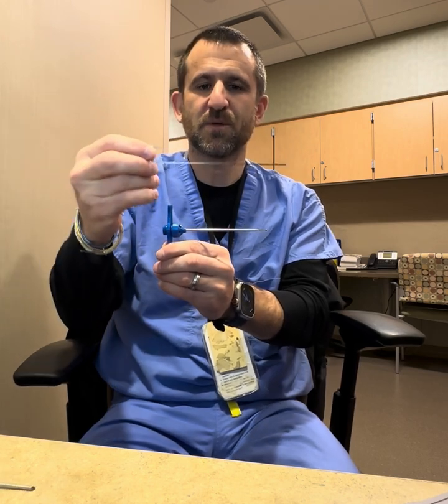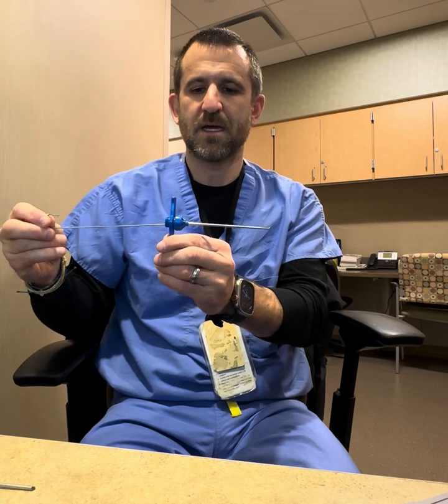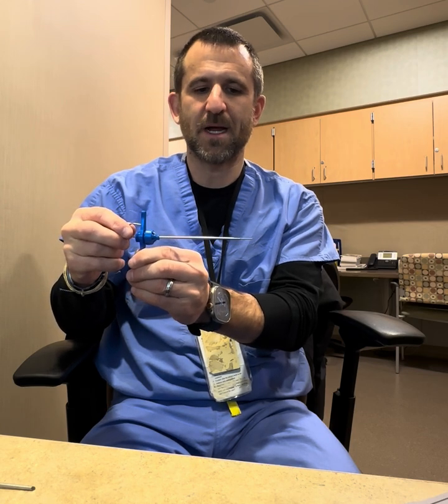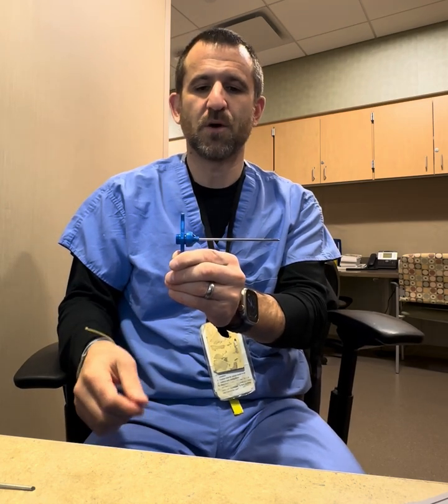Then we're going to use the shepherd's hook to go down the center of the needle and push the sample into a specimen jar so it can be sent for either culture or biopsy or both. So again, this is the demonstration utilizing a Jamshidi needle to harvest bone for either a culture, biopsy, or both.